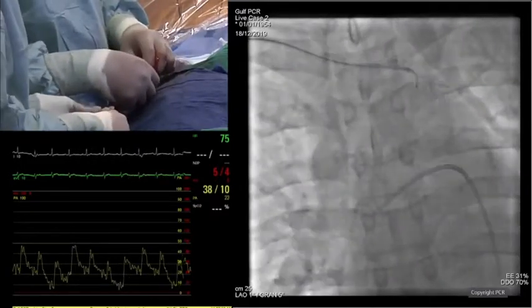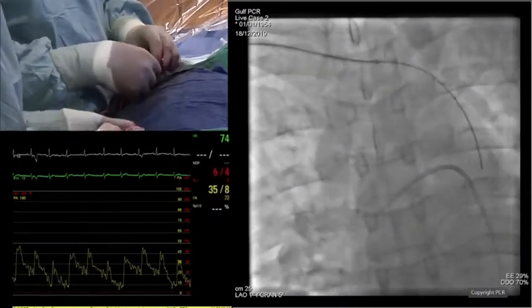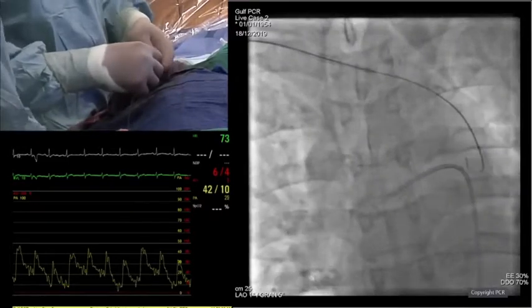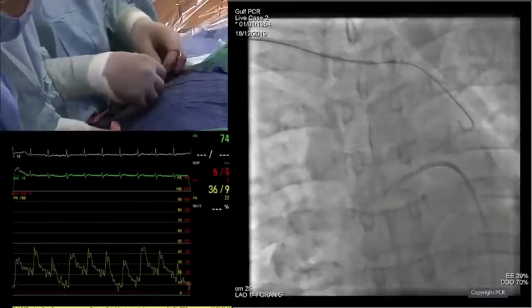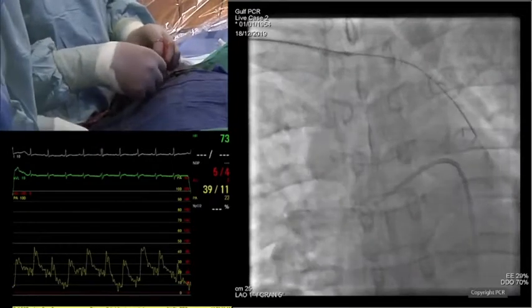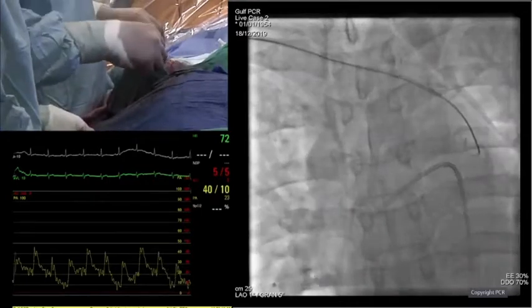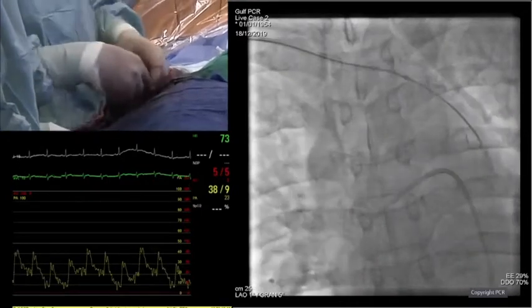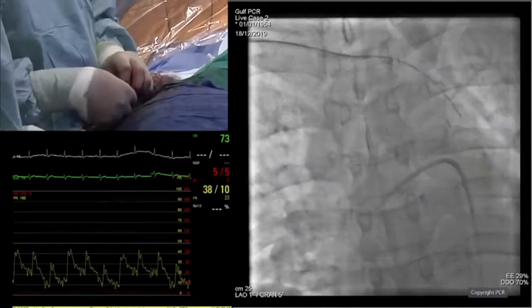So this is very important. The rest, concerning debulking or not the lesion before stenting, it's true that when you see the result by OCT, it will be maybe easier to move to the balloon followed by stenting.